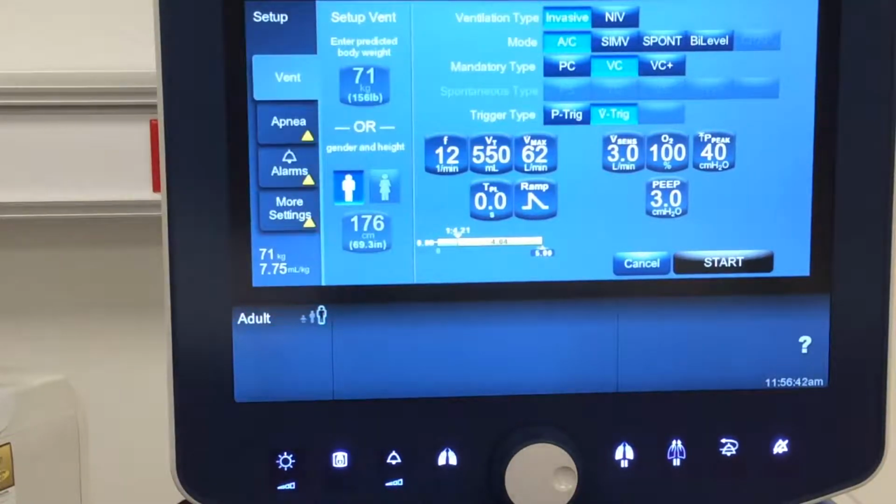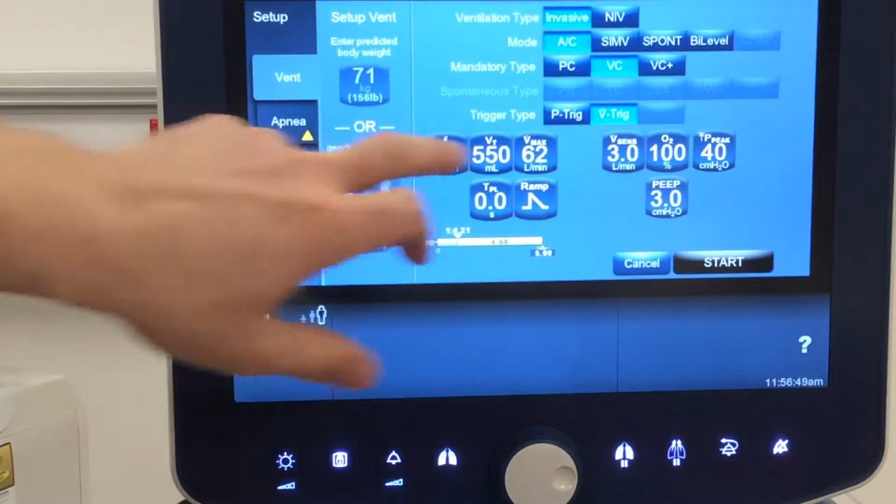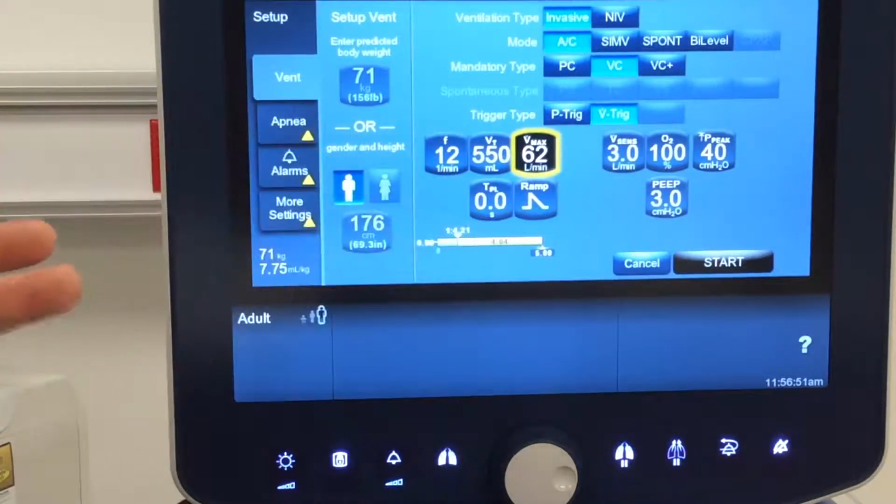So think about the implications of that for a second. Do you take the breath in the same size and move that flow rate, that inspiratory flow, the same every single time? Absolutely not. It can be quite uncomfortable for a lot of our patients as they become active breathing, as they start waking up from sedation and getting a little bit better. And we'll talk more about that.